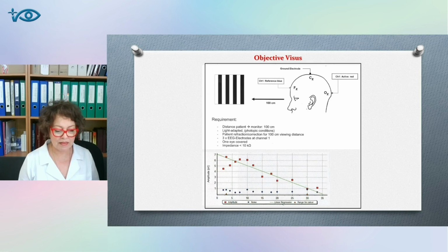At the point when the patient's visual acuity no longer allows distinguishing the bands on the screen, the two curves merge and the relative amplitude of the bioelectrical response drops to almost zero. This means that the patient is no longer able to distinguish between moving lanes, and determines the maximum visual acuity that the patient is capable of.